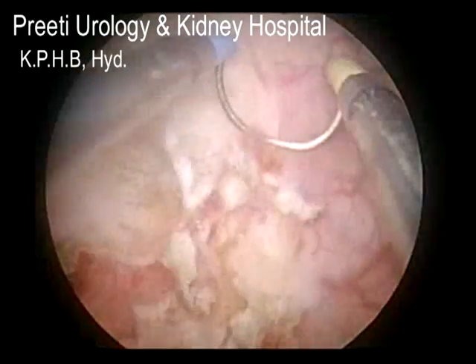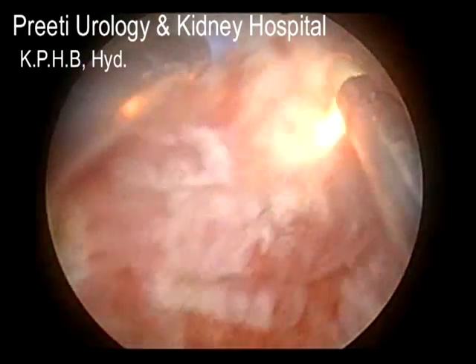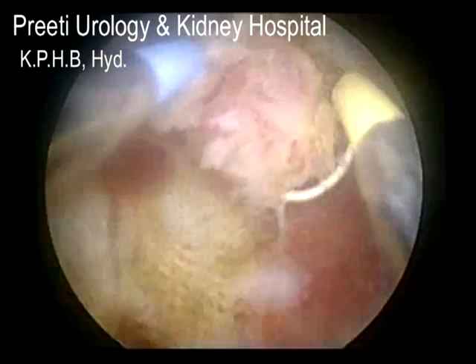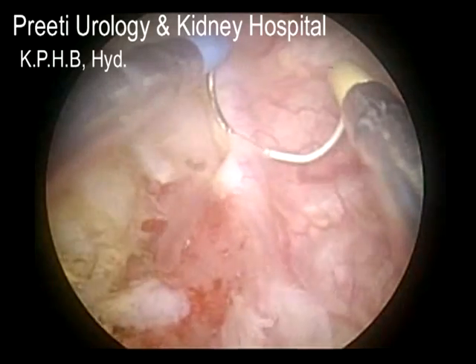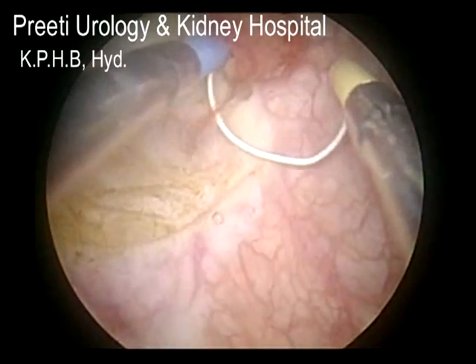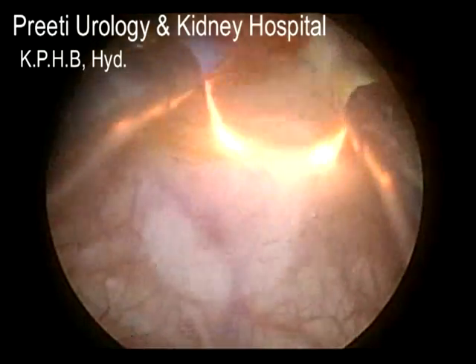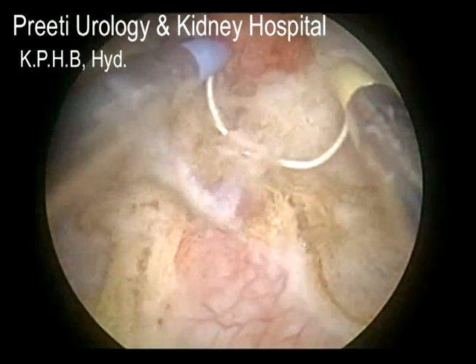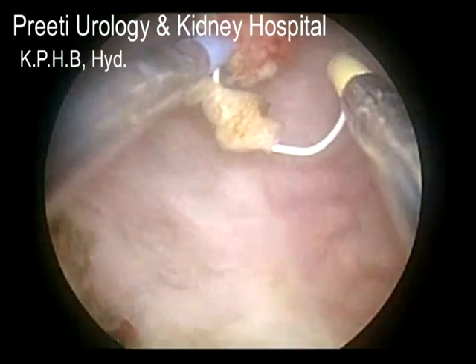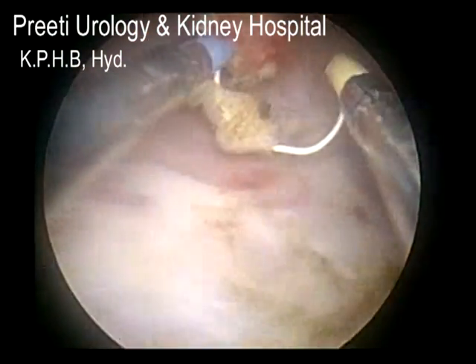Unlike in prostate gland removal, this is the core center of the bladder tumor. Sometimes when the vessels are more, we will coagulate the vessels also. At the end, the bladder mucosa should be free of the tumor, and the tumor should be completely removed, all parts of the tumor. From the edge only we should see and coagulate the tumor.